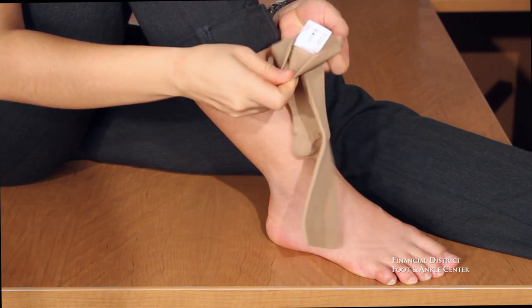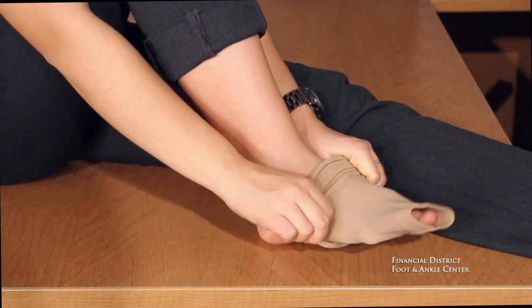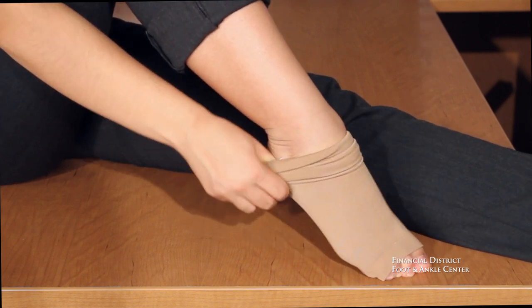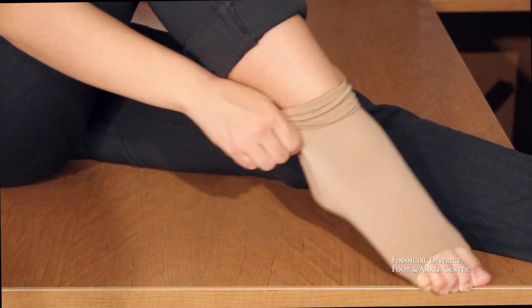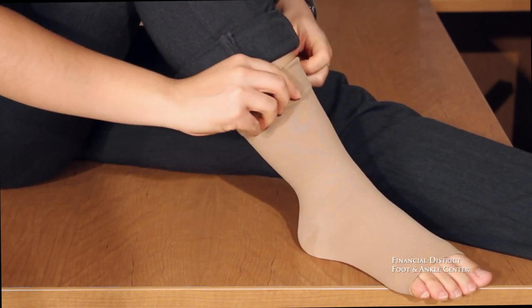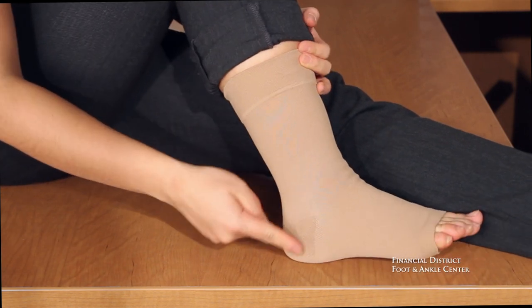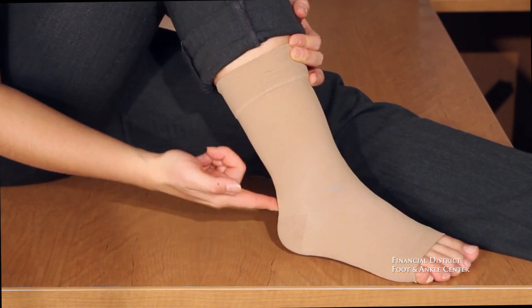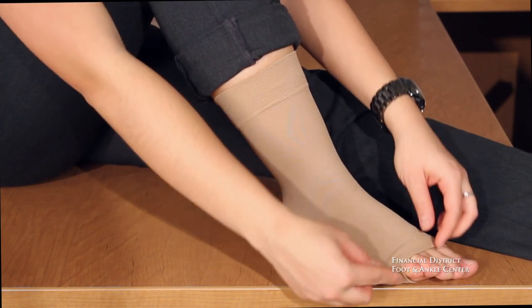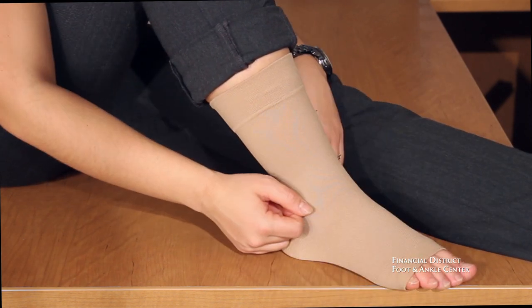Pull the compression sleeve up until your heel is placed in the heel of the sleeve, and the compression sleeve is past your fifth toe. If the sleeve is over your fifth toe, gently pull back the material until your fifth digit is exposed.